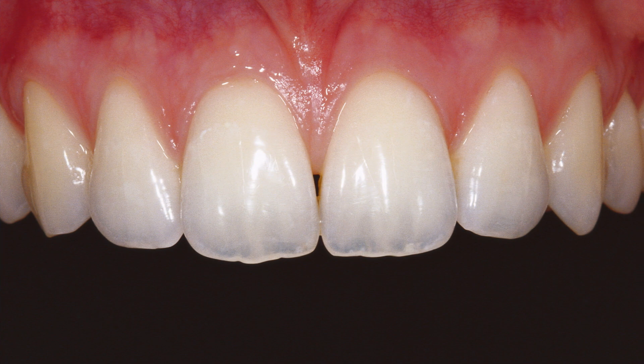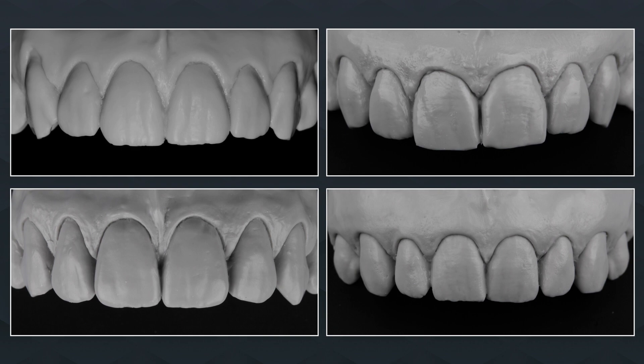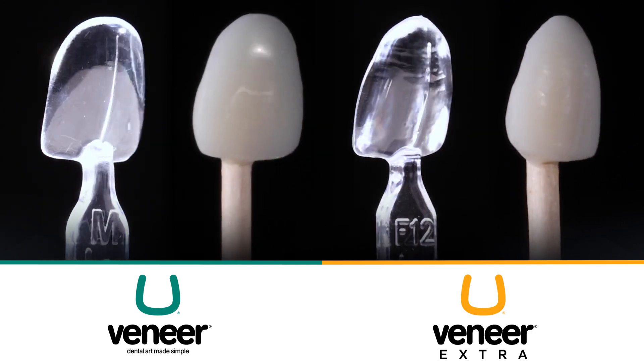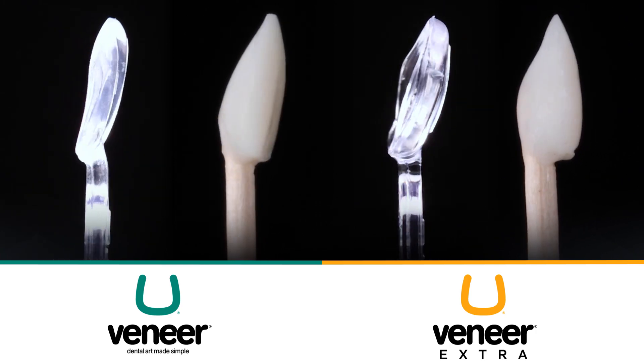The template designs have been molded based on actual scanned teeth and, as a result, require minimal adjusting or polishing for an incredibly natural look. Both kits are inspired and designed by nature, with Uveneer Extra providing the extra feature of creating natural-looking contours and tooth anatomy.